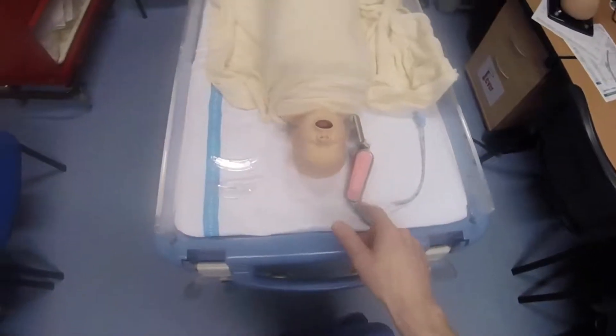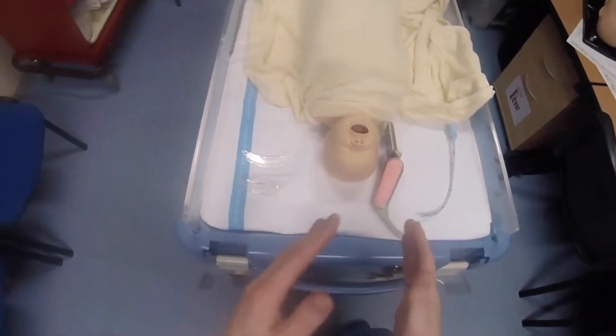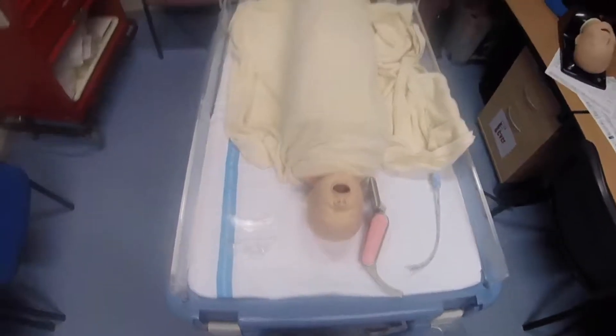There are two bigger blades which work with the adult version, so you need two different laryngoscopes — one for children and one for adults.